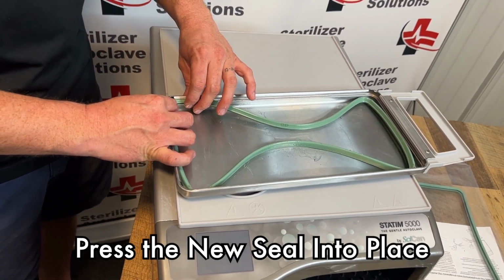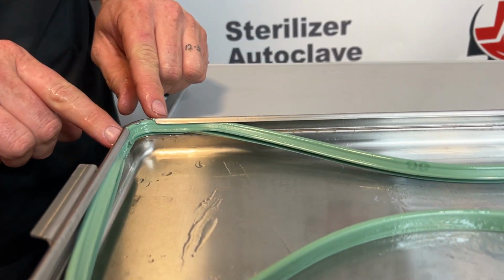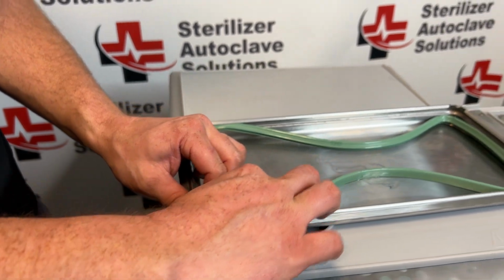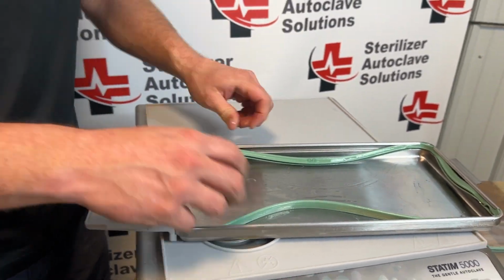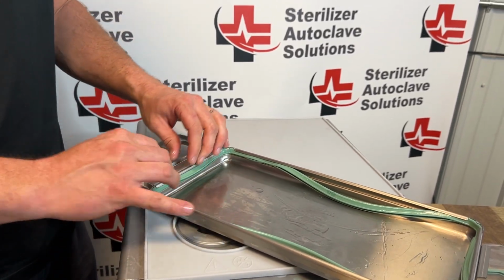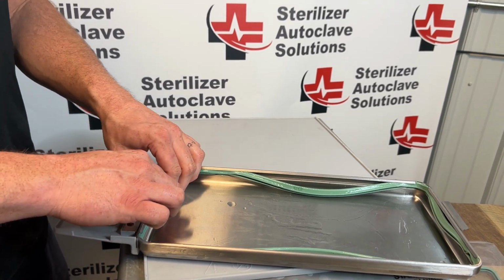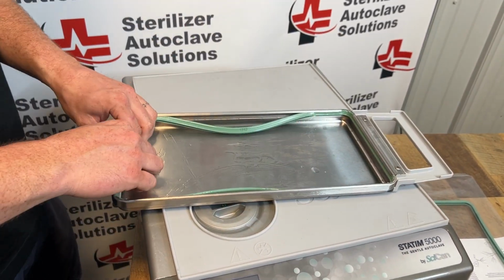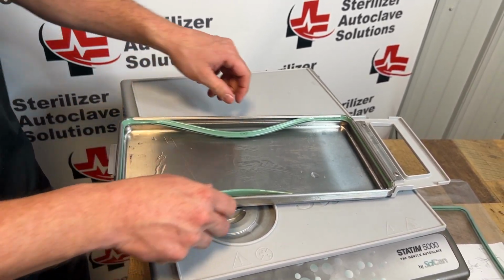Starting with one of the corners, I'm just going to pop those in so those nubs are touching on either side. We're going to do this on all 4 corners. Once you have all 4 corners in place with your nubs touching on either side, I'm going to press in on your short sides. And you can kind of do a sweeping motion on that.